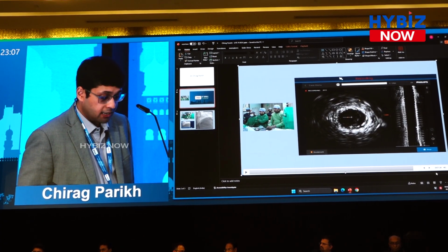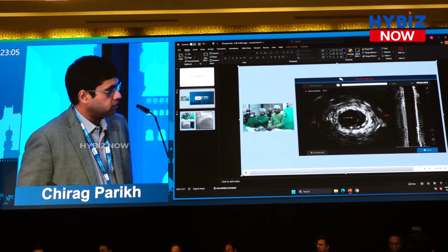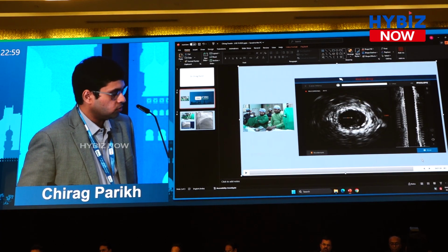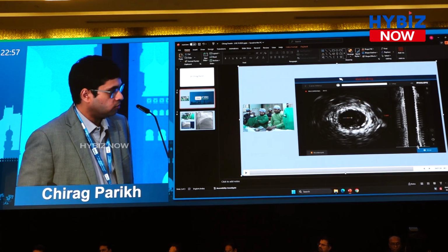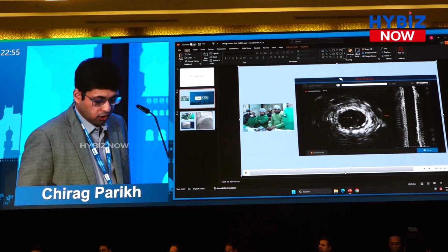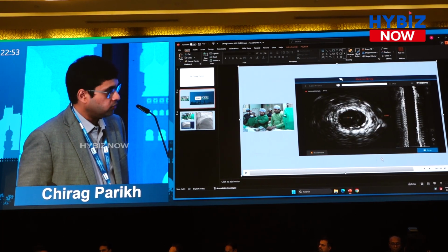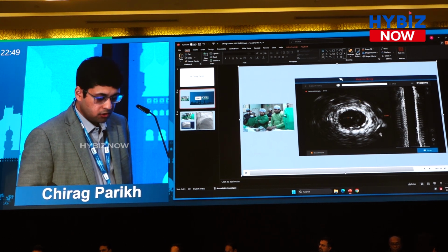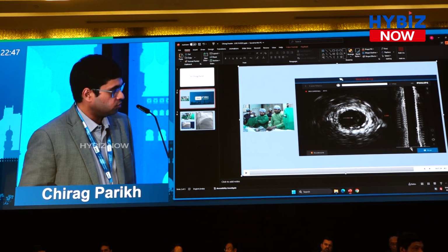The last possibility would be a spontaneous coronary artery dissection, which also cannot be ruled out. He had an ACS presentation. So recanalized thrombus would be on top of the cards, but we cannot rule out ISR.